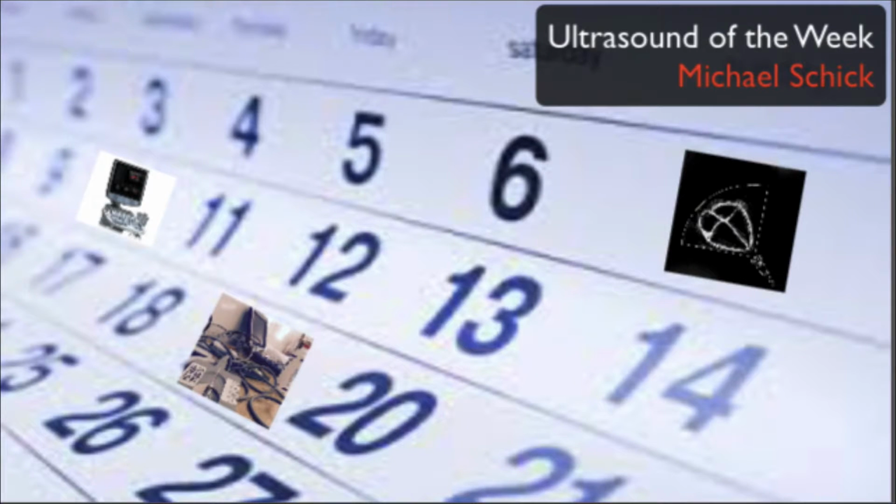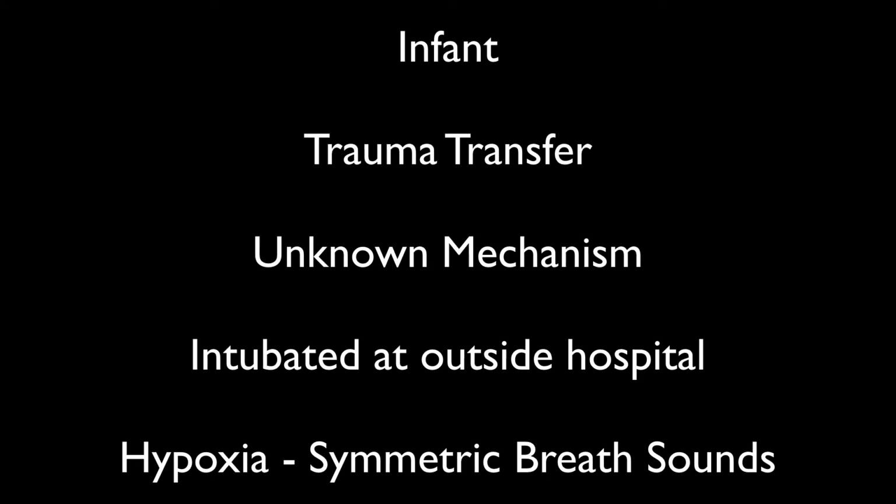I'm Dr. Michael Schick. This week we have an infant presenting to your emergency department. The patient was a trauma transfer with an unknown mechanism. The patient was in respiratory distress at the outside hospital and was intubated and comes in that way to you. However, the patient has been hypoxic en route and is hypoxic in the high 70s when they arrive, but has symmetric breath sounds on auscultation.